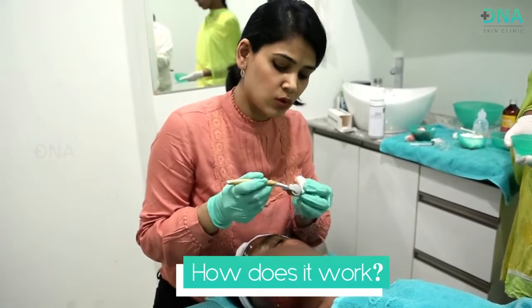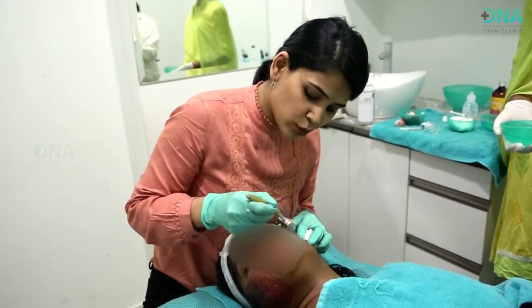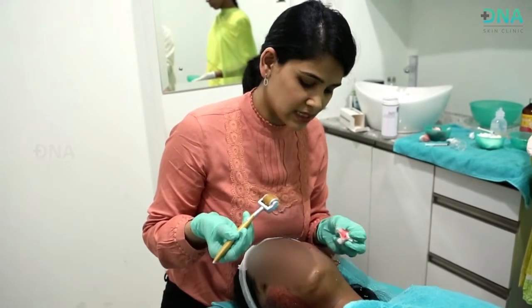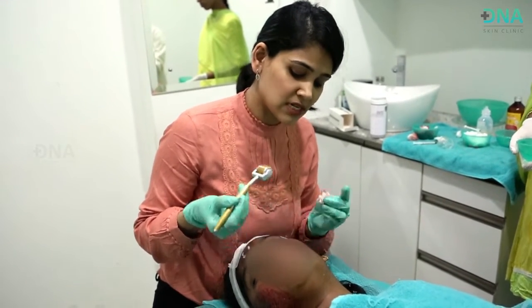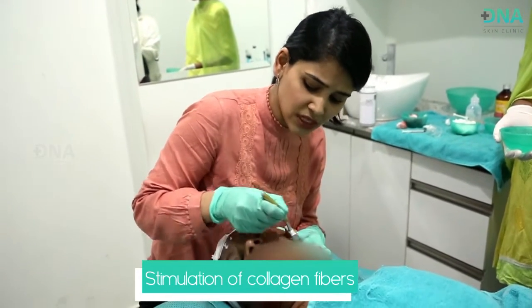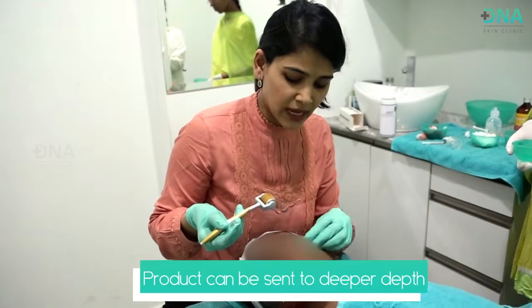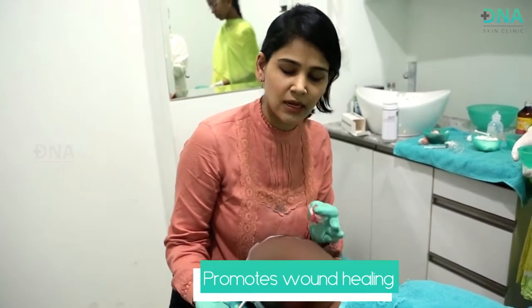So how does a Dermaroller work? What does it essentially do? Well, it produces multiple tiny injuries or tiny wounds on the skin, because of which several things happen. One, there is stimulation of production of collagen and elastin fibers. Two, because of the tiny wounds, the desired products can be sent to a much deeper depth. And three, it causes stimulation of wound healing, therefore improving the scars or the tiny blemishes that you see on the skin.